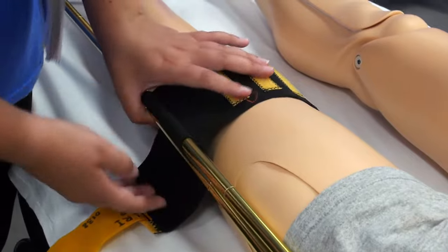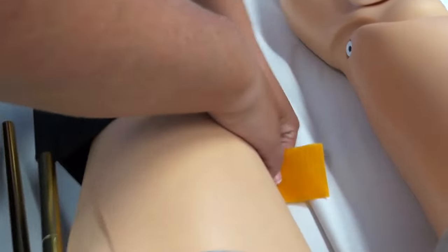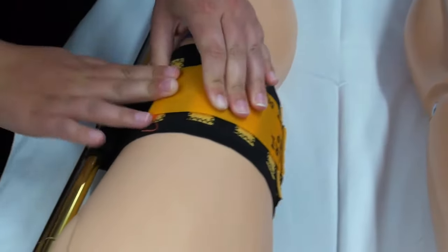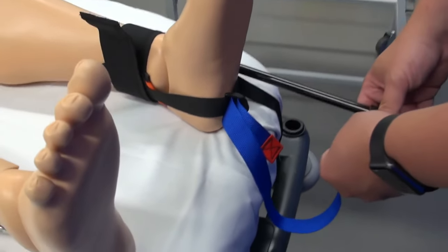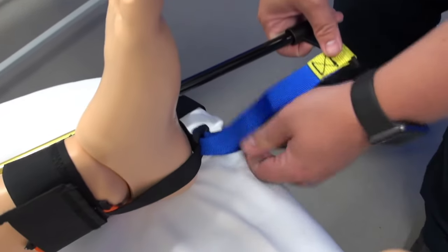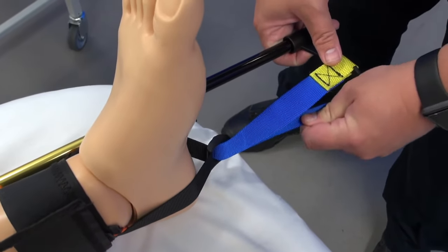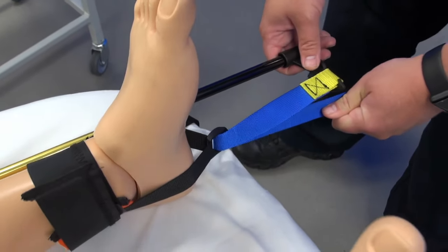Attach the elastic knee strap with the velcro. Next, put the yellow loop onto the end of the traction bar and pull the red toggle until it's nice and tight. Keep pulling until you get enough traction to mobilise the leg.